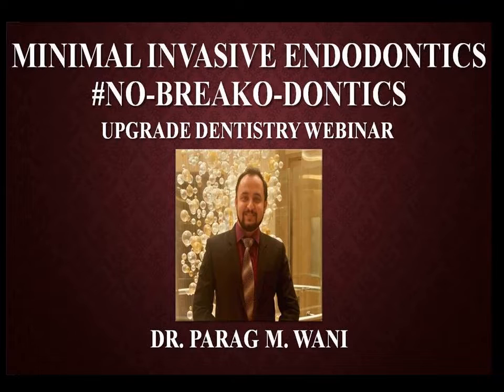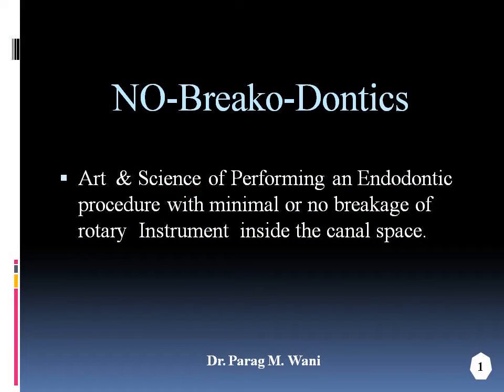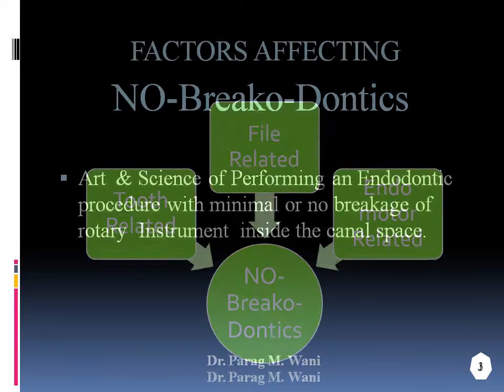No breakodontics. No breakodontics is a technique, a science of working on a tooth with a proper access opening, a good file system and proper endomotor settings to achieve a result that has minimal or no breakage inside the canal.